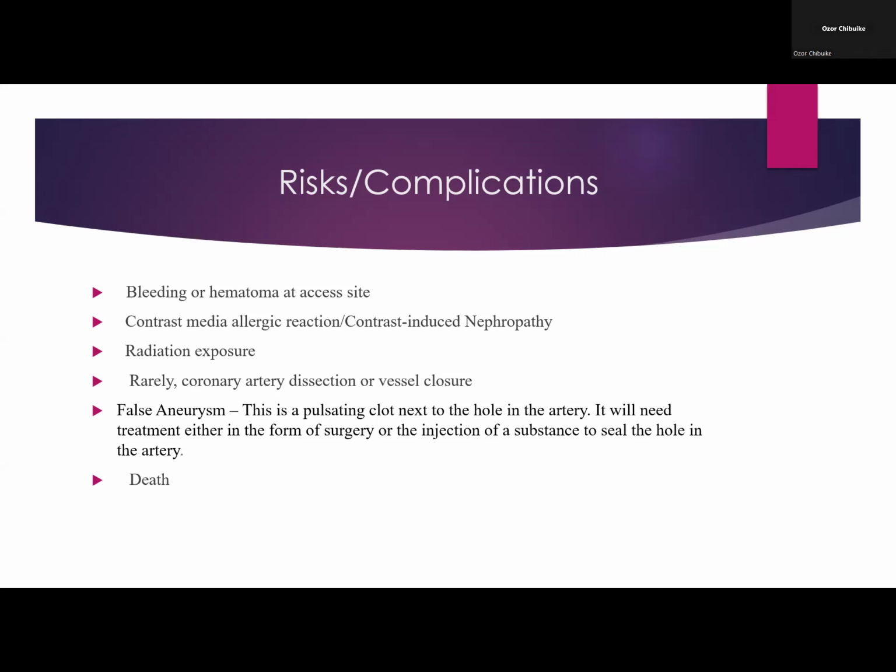alternatives are usually advised. Now, to take care of the problems related to contrast reaction, we have talked about history. However, these days we have the non-ionic contrast media. Of course, we have the ionic media, and then the non-ionic contrast media. The thing with the ionic media is that they are less expensive. However, because of their high osmolality, they have a higher incidence of adverse reactions.